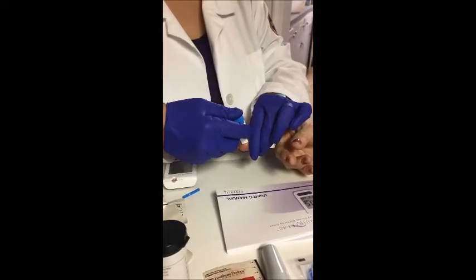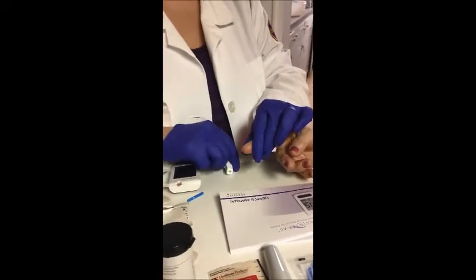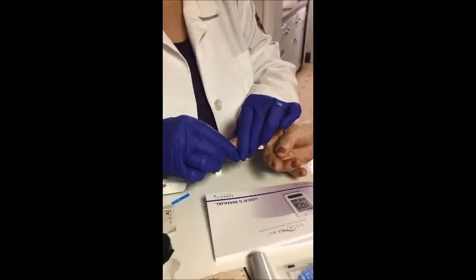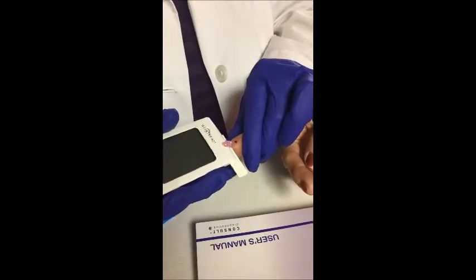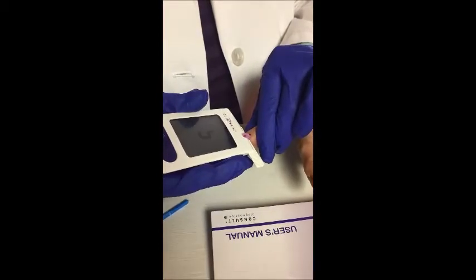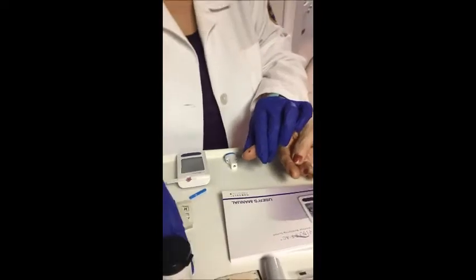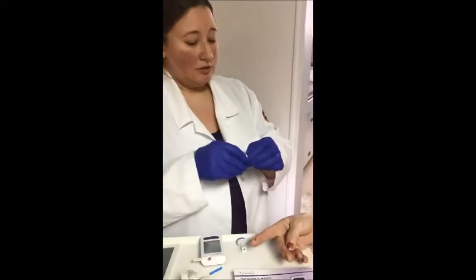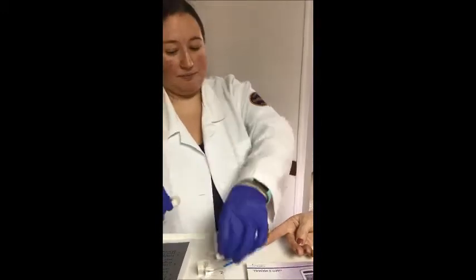We're going to hold this against your finger and push down on the blue button. You may have to squeeze to get a drop of blood. Hold the test strip up against the drop of blood, and we'll wait for the results. Once you have your results, you would put your blood glucose reading on a log.